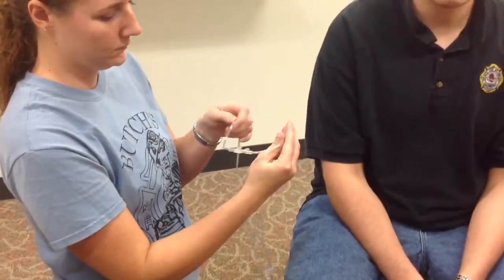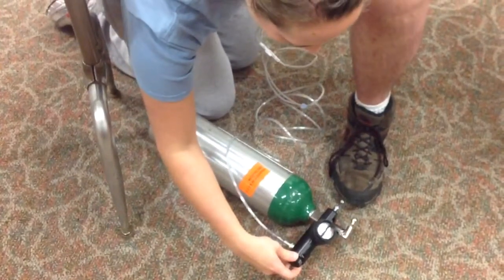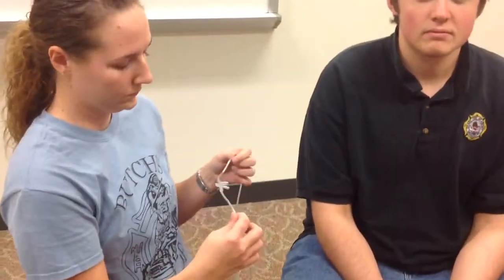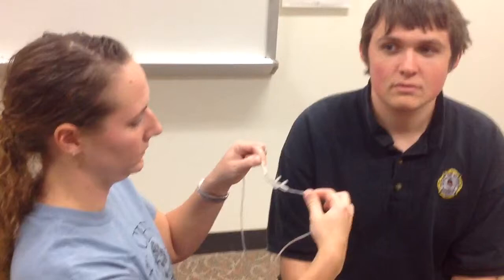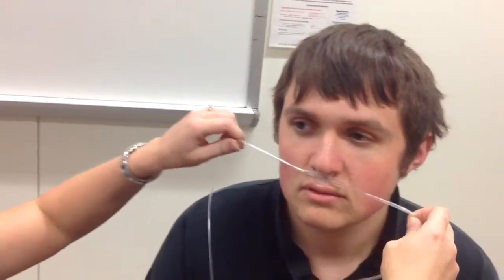Next, adjust the flow meter to one to six liters per minute. Once it's at the correct amount of flow, make sure that the prongs are curved toward the throat of the patient with a flat position above the lip. Position the prongs into the patient's nostrils while sliding your hands along the tubing to place around the patient's ears. Once in place, slide the slip hook to the appropriate length so it is under the patient's chin, approximately an inch below the neck. You are now ready to properly administer your oxygen via your nasal cannula to your patient.